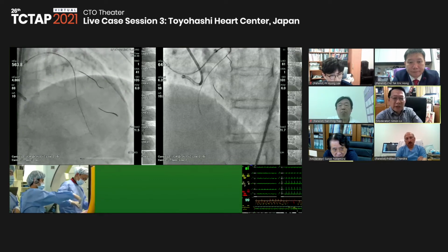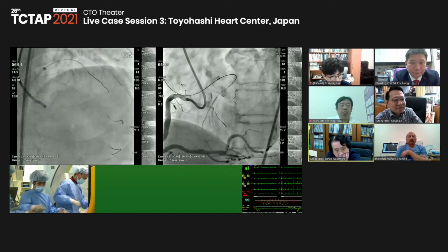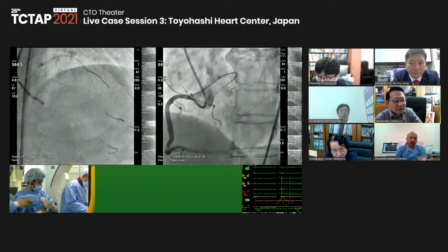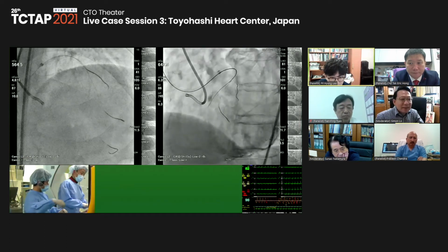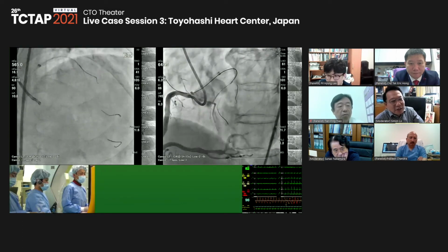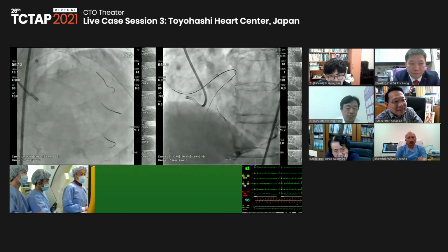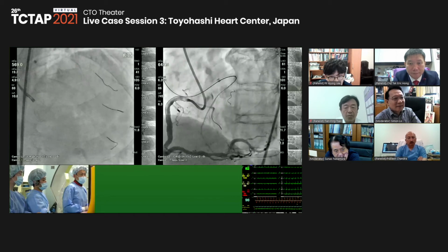The previous angiogram showed this diagonal to be quite a sizable diagonal. But of course, I don't want to implant a stent in a diagonal. So we can ask Dr. Nasu's strategy. Are you talking about the first diagonal or second diagonal? The first diagonal. Yes, of course. First diagonal is very big, so we need to keep the balloon or KBT or something before stenting, if possible.